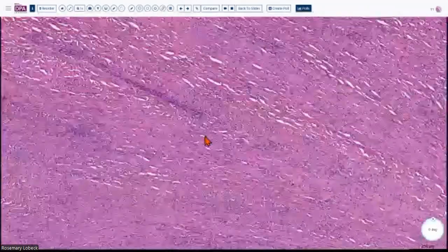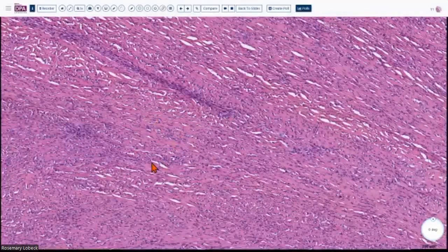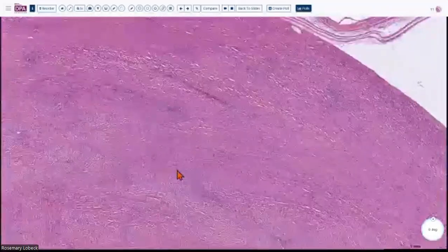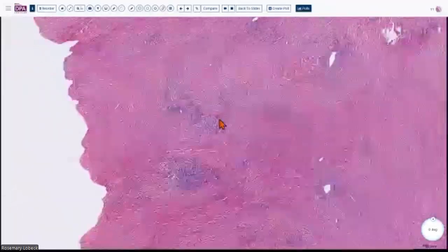So you zoom into this, you see some areas that are similar to what we saw previously, but there's a lot of sclerosis over here. And then I want to show you some specific areas in this particular lesion. Let's go over here and zoom in.